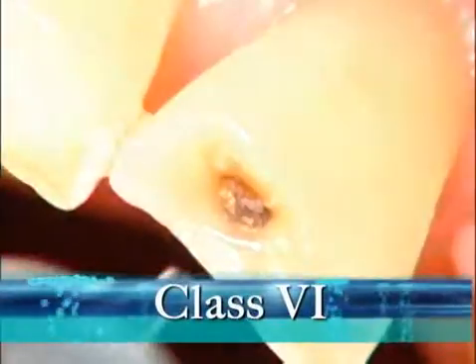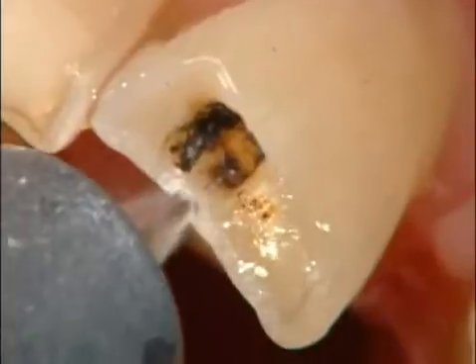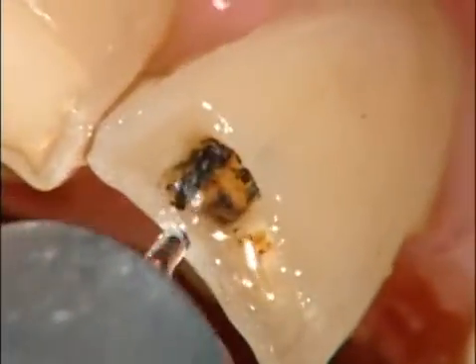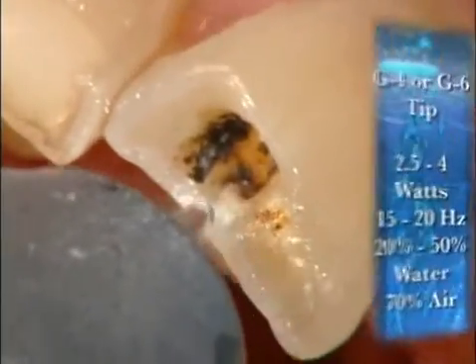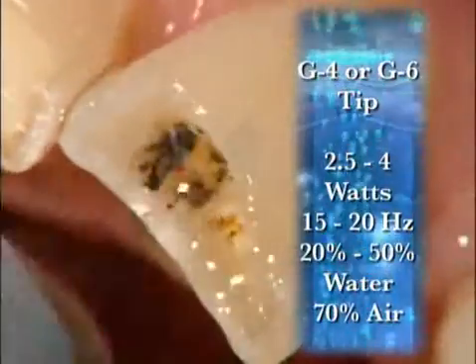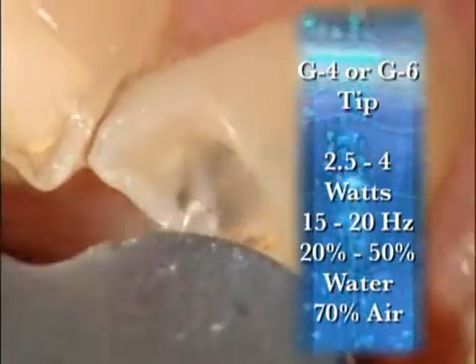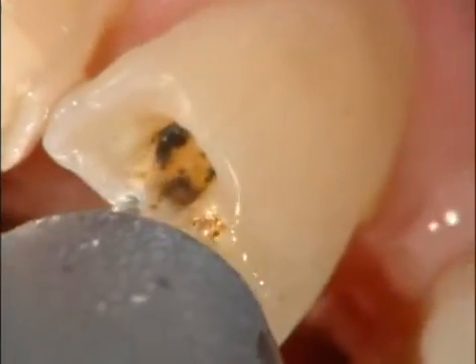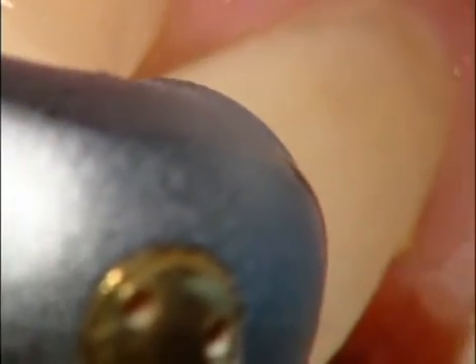Here we have a class 6 cavity prep. We have already thin enamel, a little decay, so I need to go in with lower power. I'm going to go in with a G4 or G6 tip at 2.5 to 4 watts at 15 to 20 hertz, 20 to 50% water, and 70% air. It is important to remove the sclerotic dentin. You need about 2 millimeters of reduction inside the tooth to support your composite.